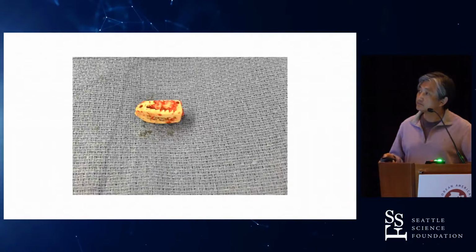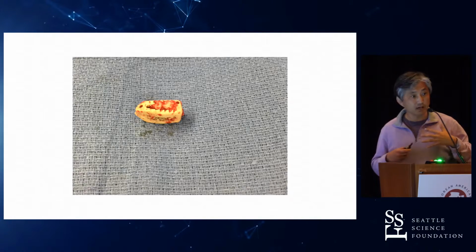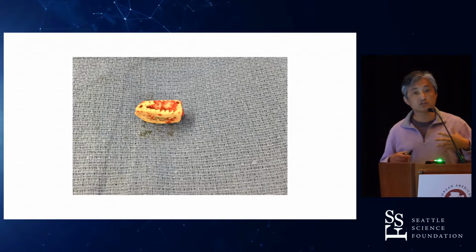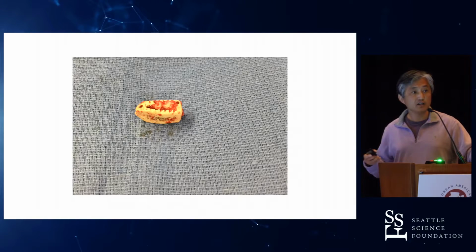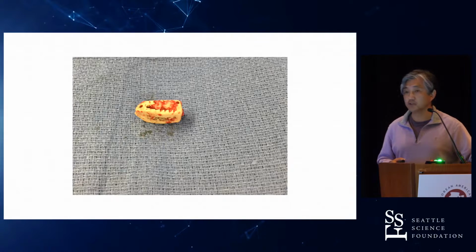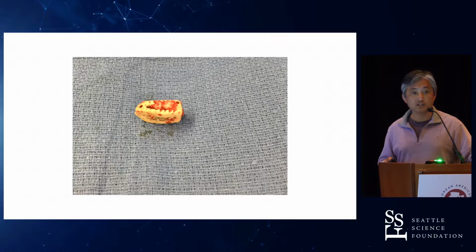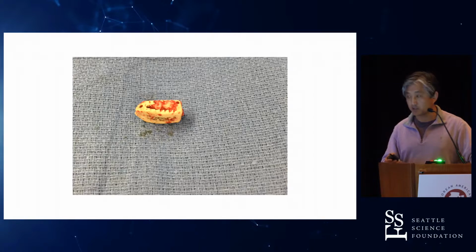And I'm sorry, one more slide. So if you did take the patient back, and I've done this with my own patients as well as patients from other surgeons, where you go and take out that PEEK cage, you do see that there's essentially just a lot of fibrous tissue around it, right? There's not really a lot of good bone incorporation. Certainly bone didn't grow into the plastic that you stuck into the patient's body, right?